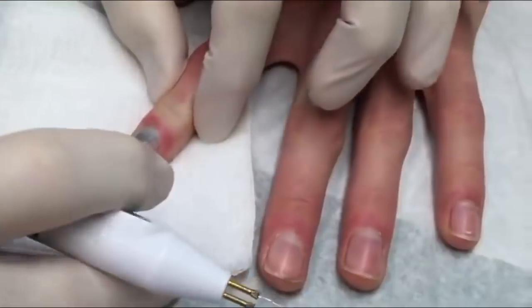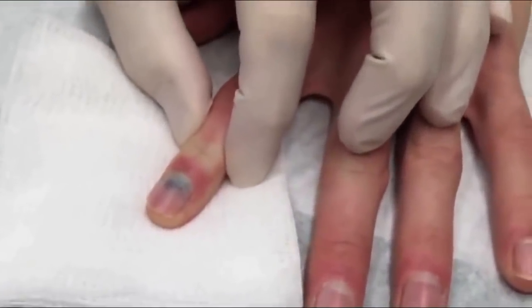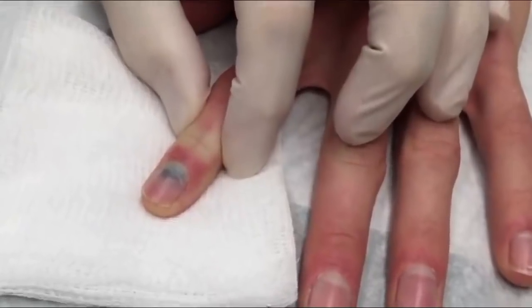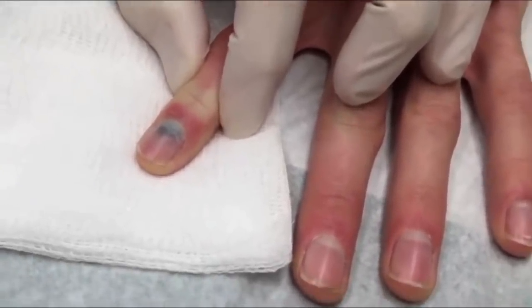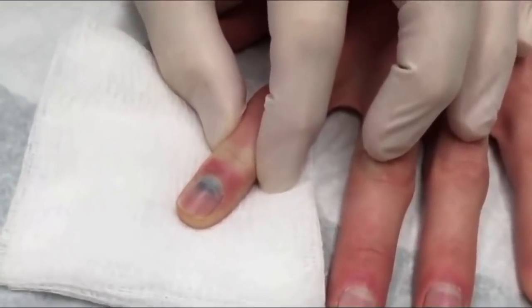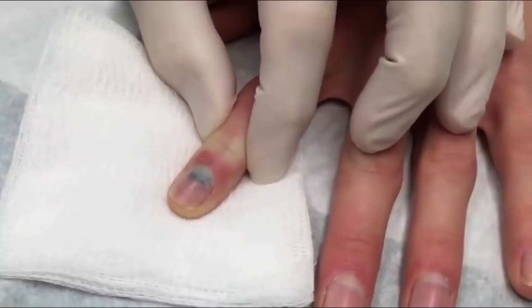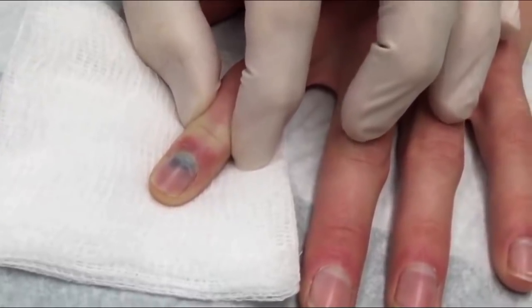What we have here is an individual who unfortunately shut his finger in a car door. We've made an x-ray and nothing was broken, but we can clearly see a subungual hematoma. So we're going to use our high-temperature loop tip cautery device to relieve that.